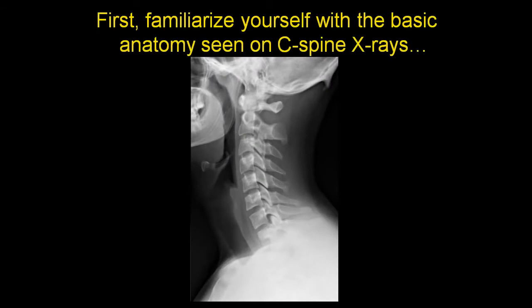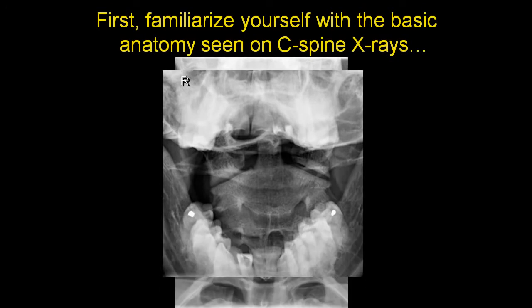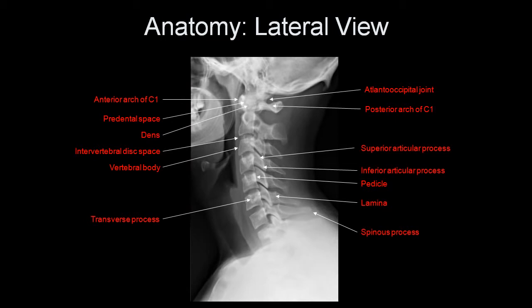It's very important to familiarize yourself with the basic anatomy seen on cervical spine x-rays, including the lateral, AP, and odontoid views. On the lateral view, be aware of the anterior arch of the C1 vertebral body, the pre-dental space between the anterior arch of C1 and the dens, the intervertebral disc spaces, vertebral bodies, transverse processes, spinous processes, lamina, pedicles, inferior and superior articular processes, the atlanto-occipital joint, and the posterior arch of C1. Remember that the first fully formed vertebral body you see is C2, not C1.